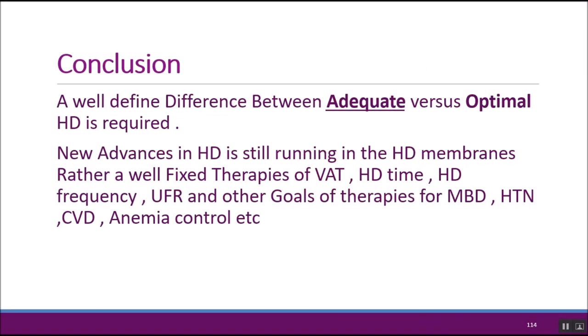In conclusion, there is a well-defined difference between adequate versus optimal hemodialysis. New advances in hemodialysis are still running in the hemodialysis membranes, rather than a well-fixed therapy of vascular access type, hemodialysis time, frequency, ultrafiltration rate, and other goals of therapy for mineral bone disease, blood pressure control, cardiovascular disease assessment, and anemia control.